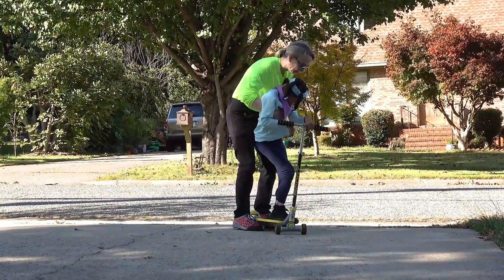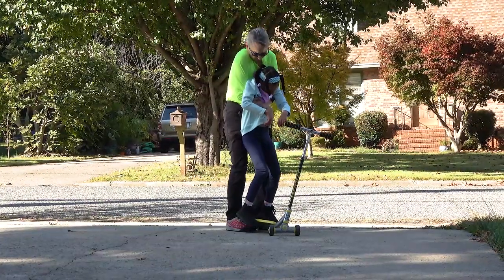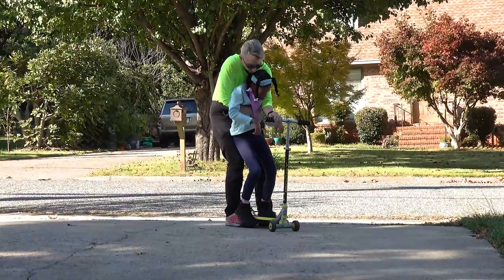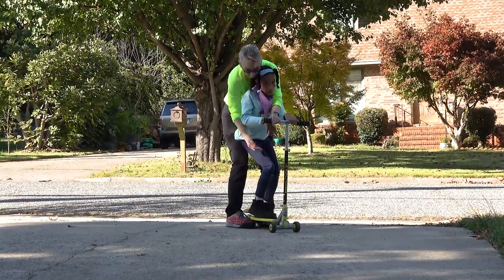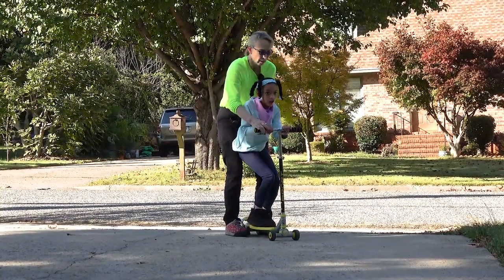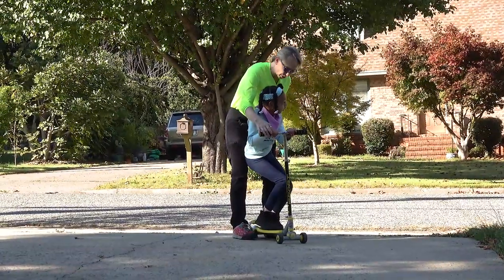Get back on the scooter. We're gonna go for a ride. Alexis loves the scooter, but right now she wants to get off. Hold on tight, sweetie. We work on it for standing balance, and she really needs to learn to use her arms to hold her weight so she can stand.